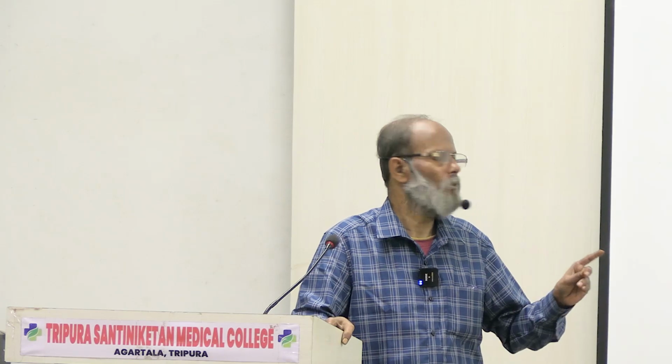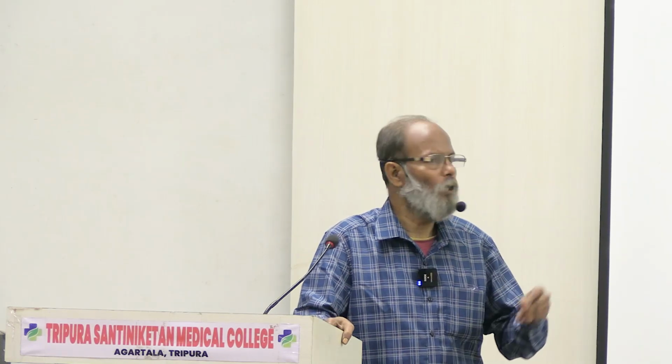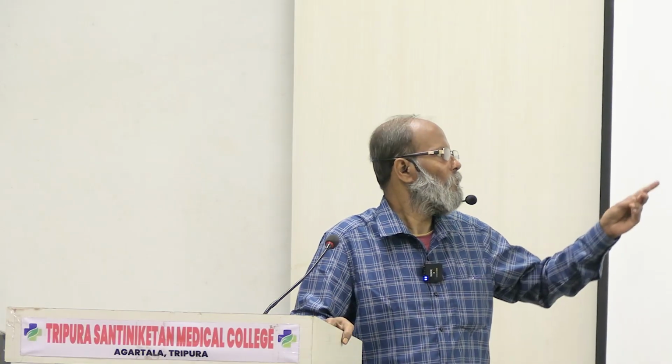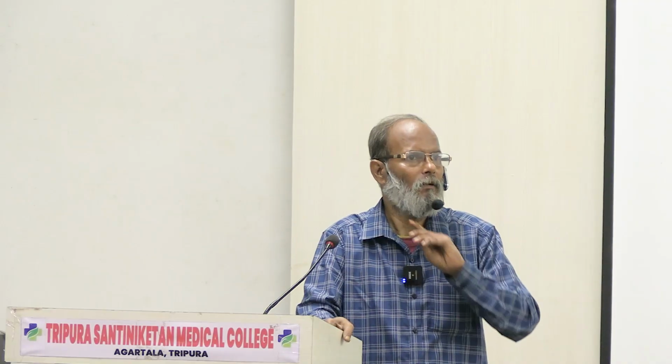We put the cystoscope through the urethra, and from there dye is pushed up into the ureter. This is the cystourethroscope guided contrast media application.